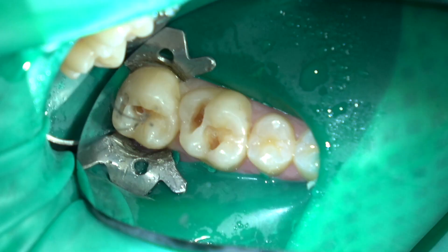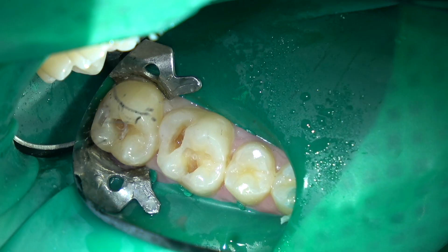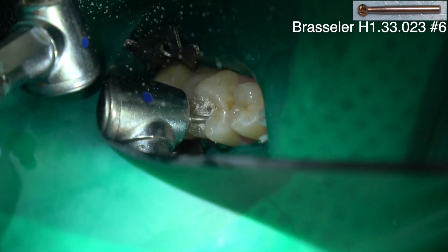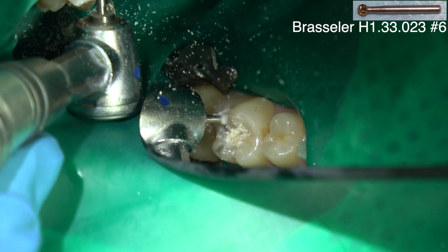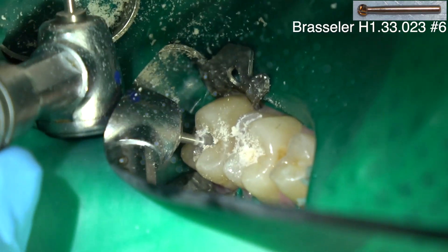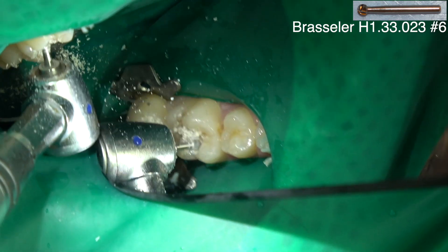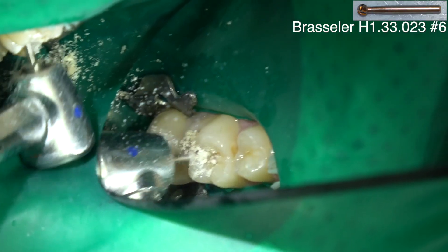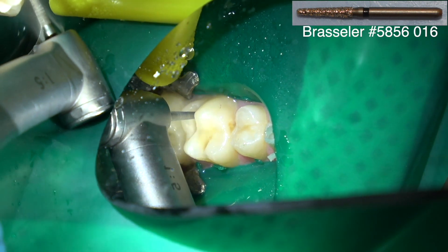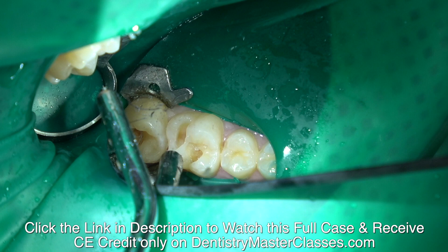So I'm opening this up — I want direct access to the decay. Now I'm coming in with a number six round burr. I prefer number six; just whatever size you like — if it's small you might use a number four, but I usually use a number six for decay removal. The slow speed handpiece will just remove the decay and, unless the dentin is really soft, it won't remove the healthy dentin. It's just like termites in a wall — they make a small opening in the enamel and then blow up once they get into the sheetrock. The dentin is like sheetrock. I haven't started on this one yet — checking it with my explorer.